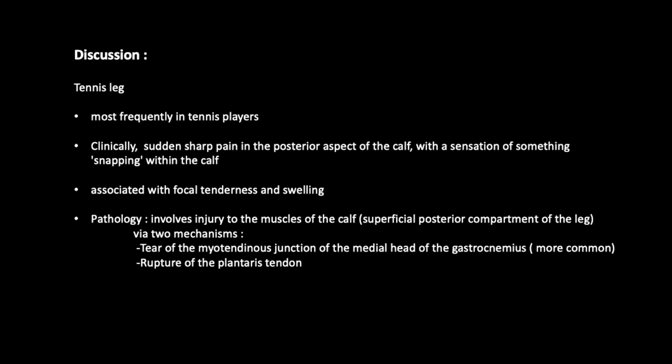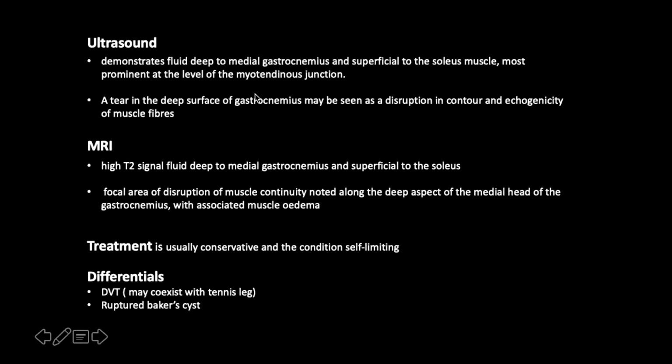It was common in tennis players, but I see it's a very common entity while playing cricket. In the classical history, after running, the patient gives a sudden sharp pain with a sensation of something snapping within the calf. This can present with huge swelling, but on ultrasound, you can see that there is a fluid collection, and in the myoaponeurosis, there is a tear in the medial head of the gastrocnemius.